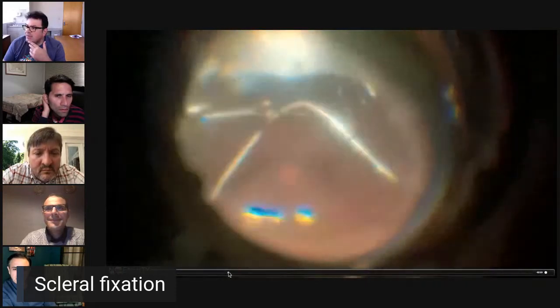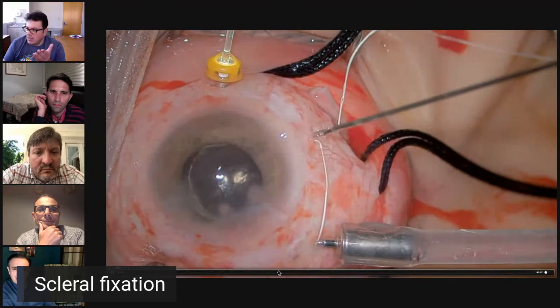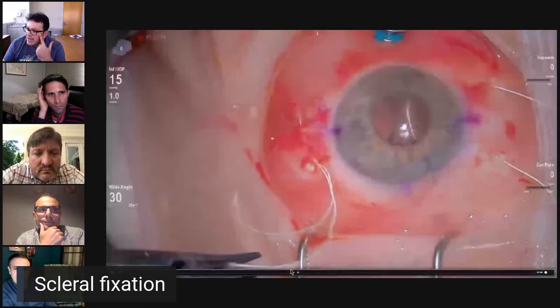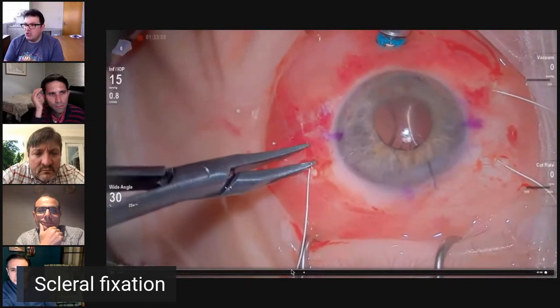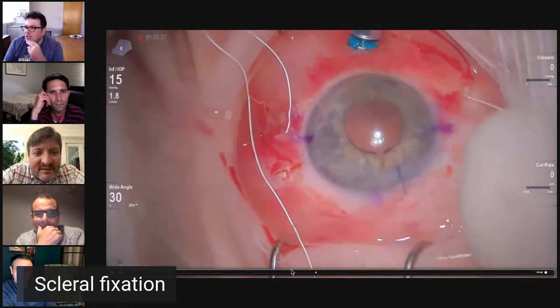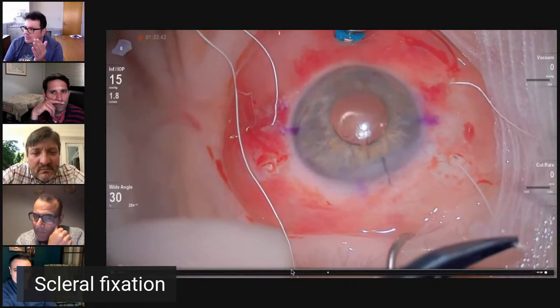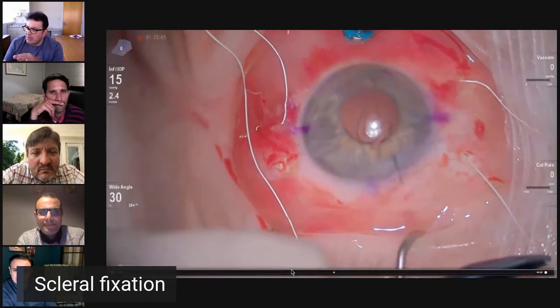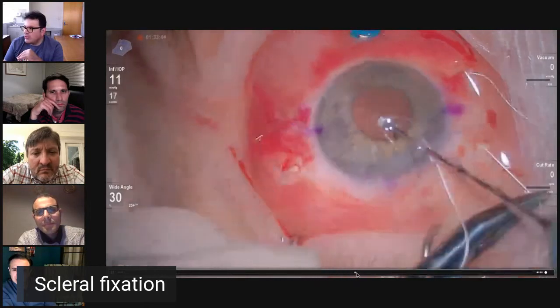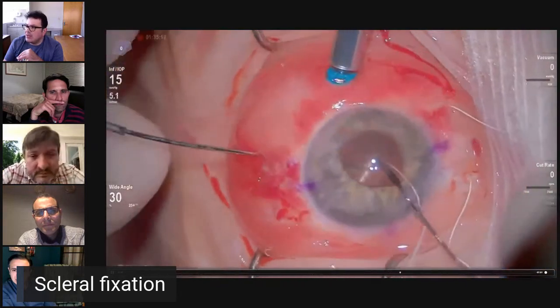And then you do the same thing from the other side, and then you're in, you're fine. And then this is another case as well, where I was pulling the suture out. I was doing Chris's technique here, and I was pulling the suture out, and it all came out. So now I need to thread this side again with the lens being inside the eye. Because the lens was anterior, you can manipulate it from an anterior wound. So I did the same thing, but from the corneal wound, and it was actually easier.